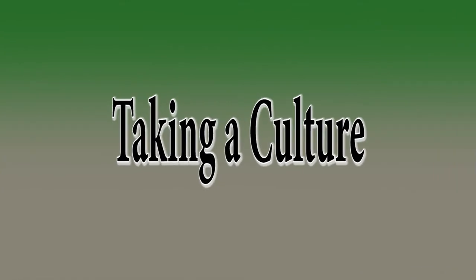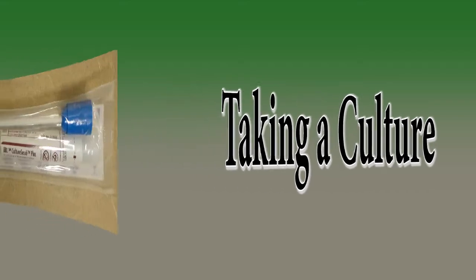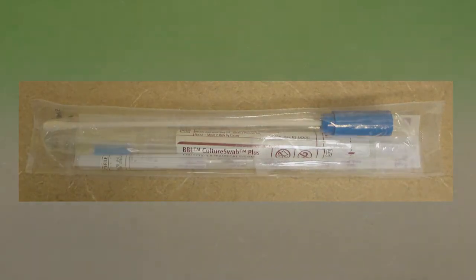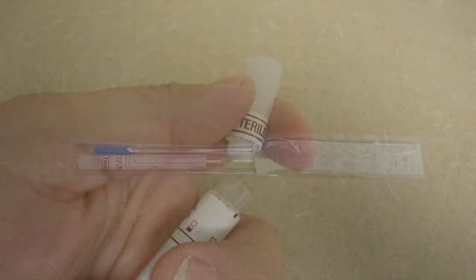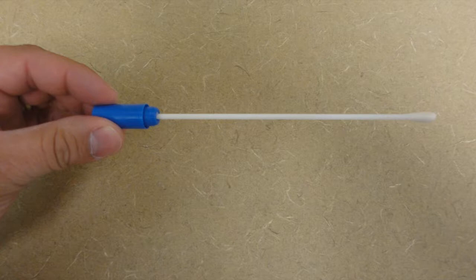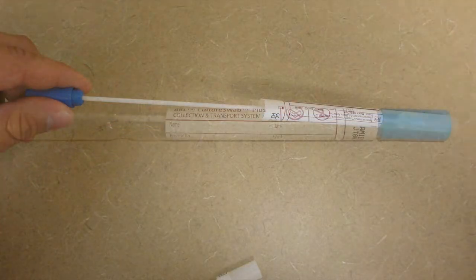When a patient has a new or ongoing infection, the physician will oftentimes take a wound culture using a culture swab. You'll need to retrieve a swab from the top drawer in the room and open the pack. The doctor will twist the cap off and take the swab from the container to swab the patient. You'll then place the Q-tip swab back in the container and seal it.